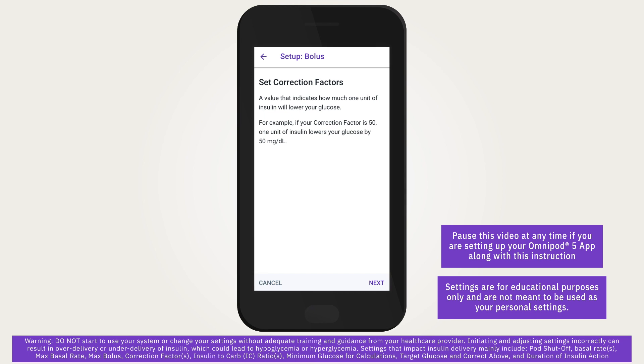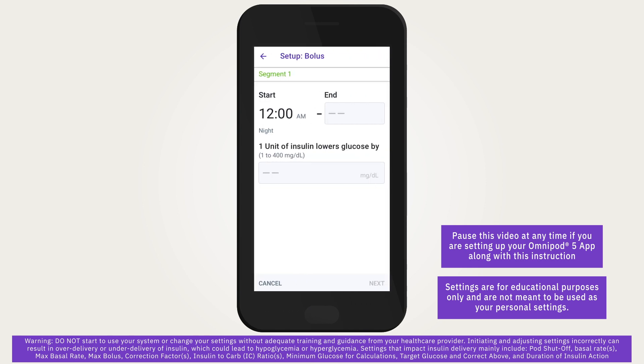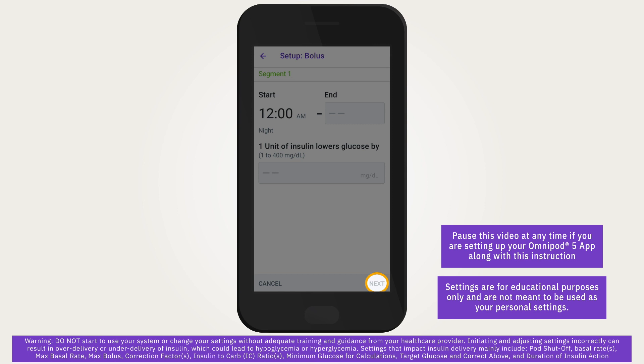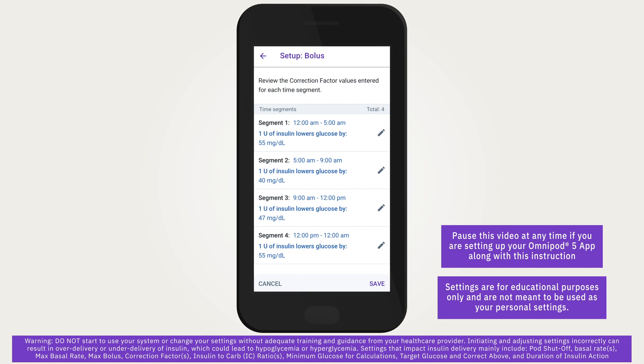Correction factor determines how much one unit of insulin lowers your blood glucose level. The smart bolus calculator uses the correction factor to calculate the correction portion of the suggested bolus. Up to eight correction factor segments can be created. Tap next to start creating segments. Tap the end time field and specify an end time. Tap the one unit decreases glucose field and specify the correction factor for this segment. Review and tap next. Repeat until all 24 hours are complete. Once everything is confirmed correct, tap save.